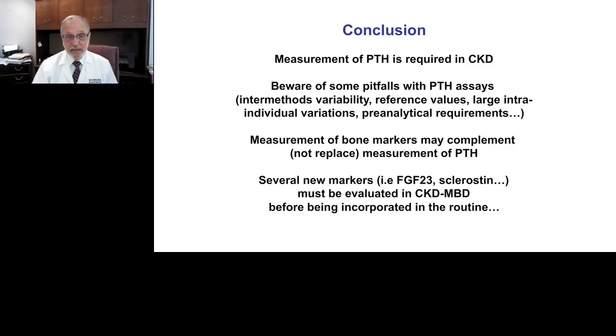So it is necessary, I think, to continue to work hard and push hard trying to achieve standardization in PTH assays, and to have some knowledge of the particular specificities, and whether other assays that don't measure these PTH fragments will ultimately be the way to measure PTH. A lot more work and data is required before that might make this whole area a little more reproducible.